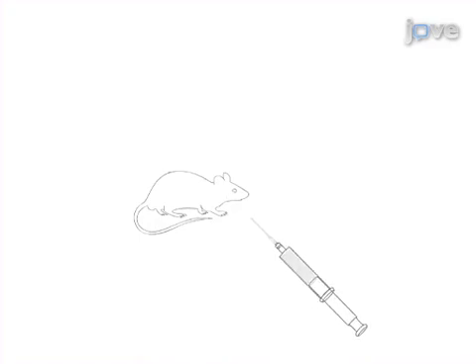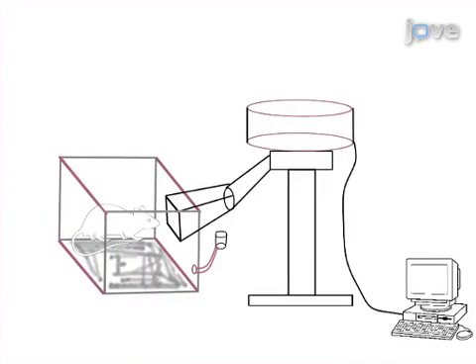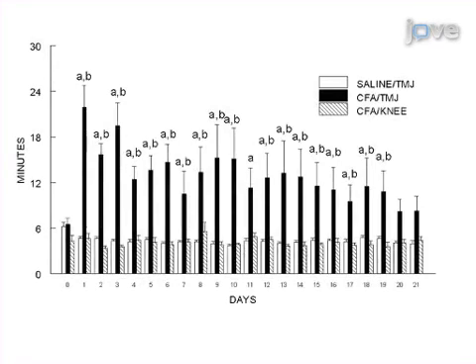control. After the injection, the animal is returned to the feeder cage and feeding behavior is observed until it returns to baseline levels. Ultimately, data are collected and analyzed to show that animals with jaw pain have longer meal durations.